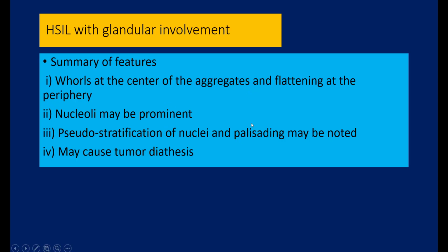Pseudostratification of nuclei and palisading may be noted. Pseudostratification and palisading are considered almost synonymous with cells showing glandular differentiation, but it is not always the case, and when HSIL involves a gland, it picks up those features of glandular lesions. So please remember that.